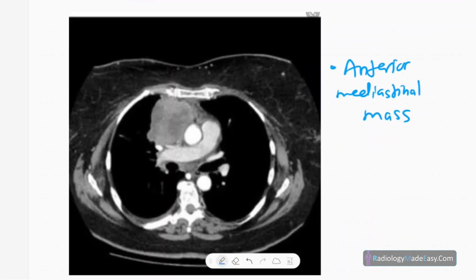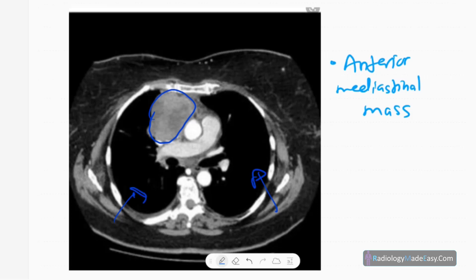The next line of investigation is contrast CT of the chest. Here in the mediastinal window, you can see an anterior mediastinal enhancing mass — this is a lymphoma mass. No lung nodules are seen; it is confined to the mediastinum.